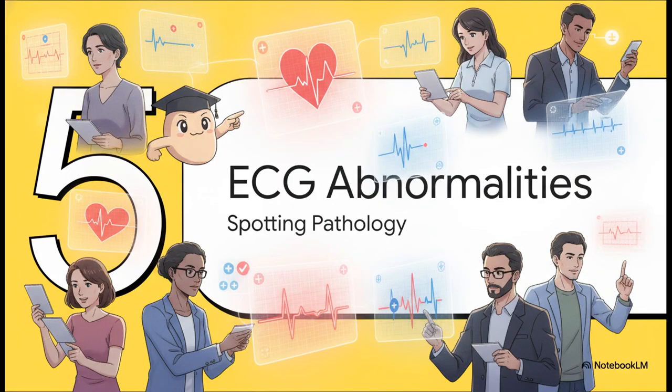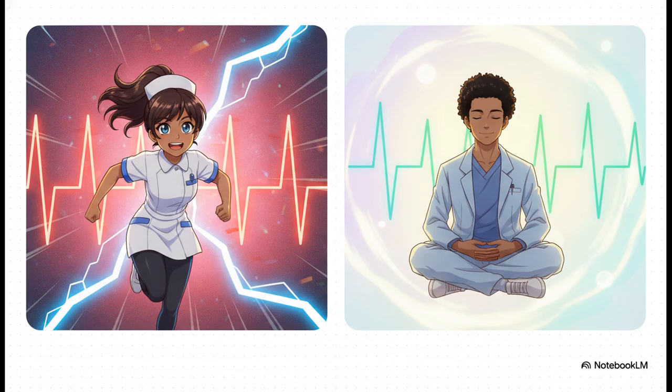Section 5. Recognizing common ECG abnormalities. We have officially arrived at the most crucial part of this explainer. This is where we learn to spot pathology, and honestly, it's where you're going to score your highest marks. Let's start off with the easiest ones, the rate abnormalities. You don't even need to do the math to spot these. You literally just look at the visual distance between the tall R waves.